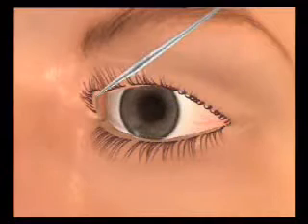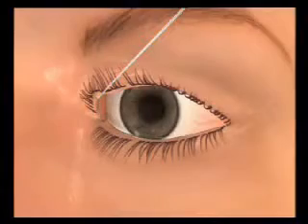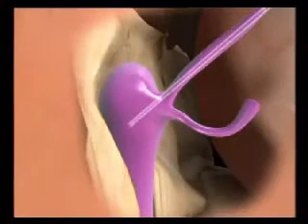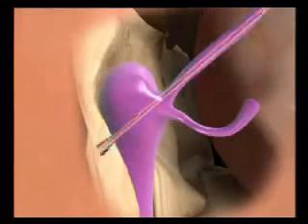The upper lacrimal punctum is then dilated, and an optical fiber is inserted and advanced along the anatomical pathways through the superior canaliculus, common canaliculus, and lacrimal sac, entering into contact with the medial wall of the lacrimal sac, confirmed by the hard boundary of the lacrimal bone. Laser energy is then delivered in pulses until the fiber passes to the nasal fossa.